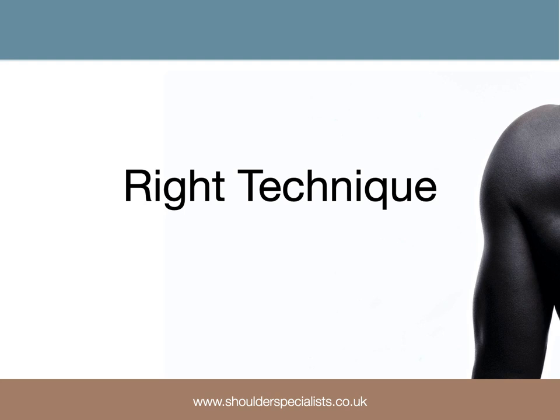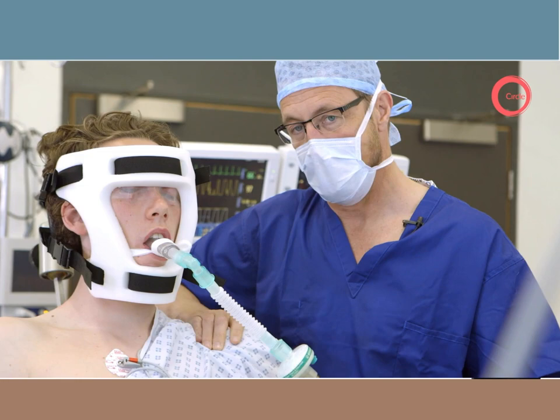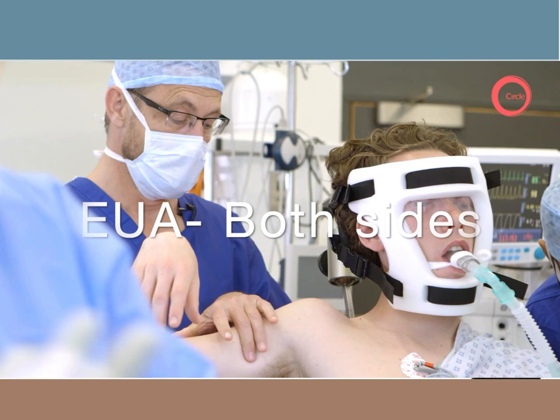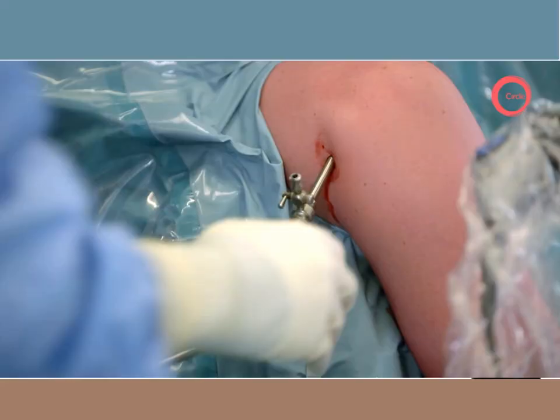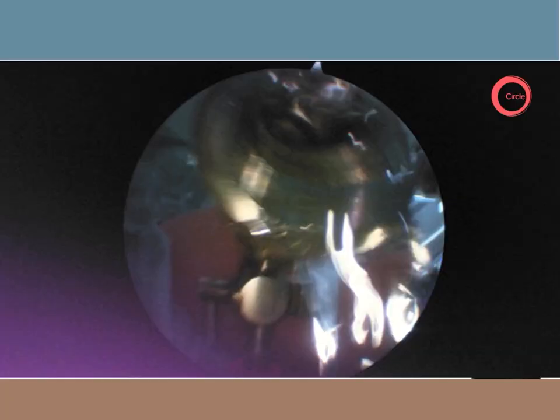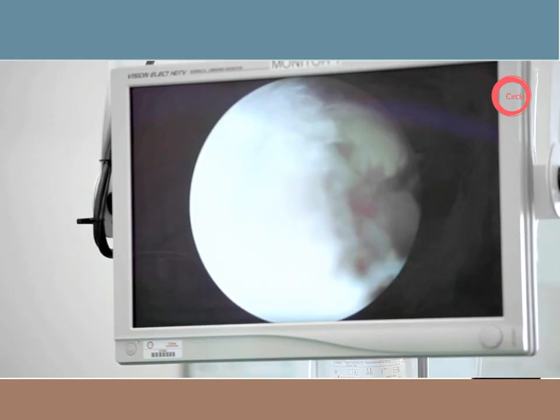In the following video, I'll demonstrate some tips for technique for soft tissue labral repairs in general. Firstly, an EUA of both shoulders should be performed before any incisions are made to assess for any differences in both anterior and posterior humeral excursion. I tend to put adrenaline in the intended port sites, not only for the hemostatic effect but also because it gives me further information as to the ideal positioning of my first portal, which is in a fairly standard position. I then assess the labral injury but also look for any bone loss or any humeral-sided soft tissue avulsion.